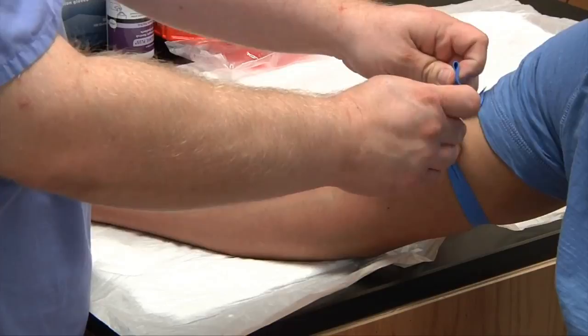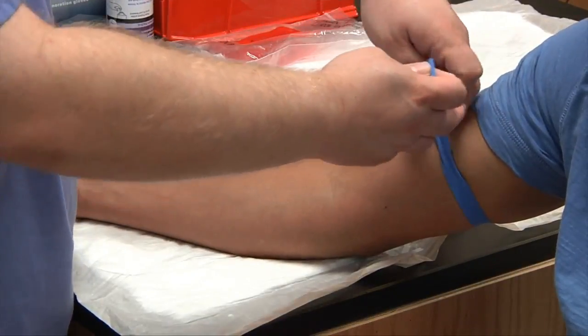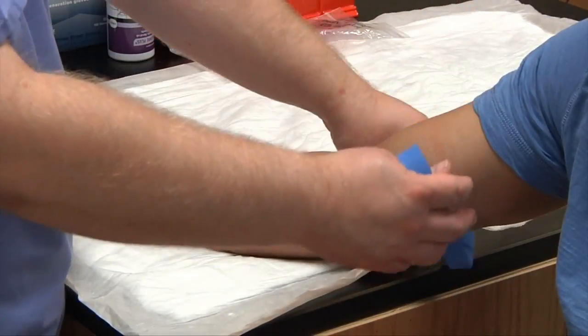Then you'll release your tourniquet application and prepare your slides. And this is tourniquet application and palpation.